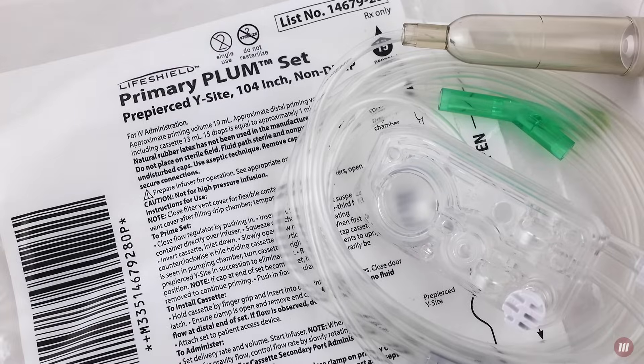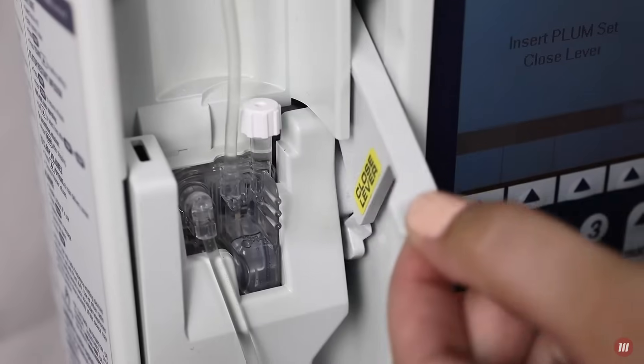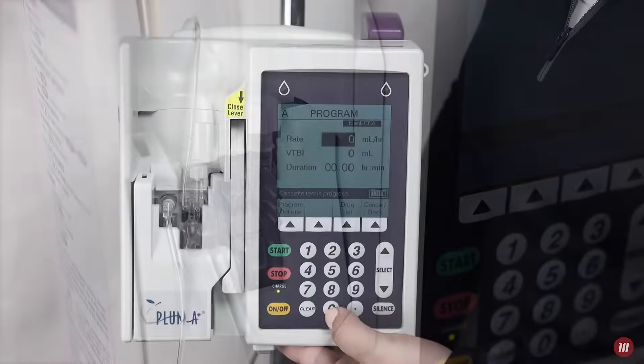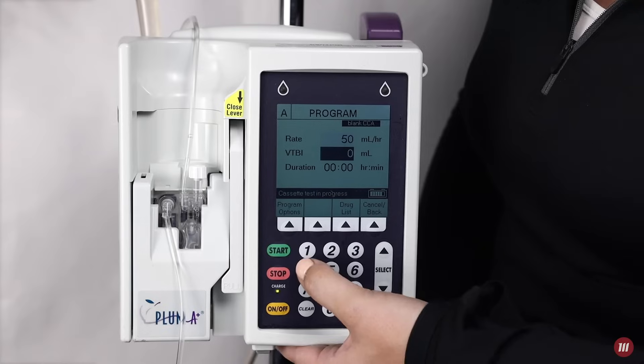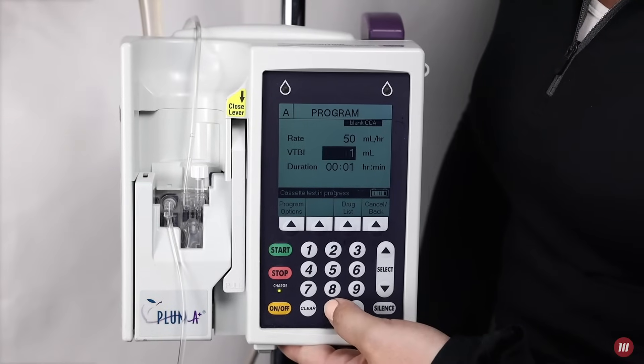Dedicated Plum cassette tubing is used to operate the Hospira Plum A Plus. Similar to other popular infusion pumps, the flow rate range is 0.1 to 999 milliliters per hour.